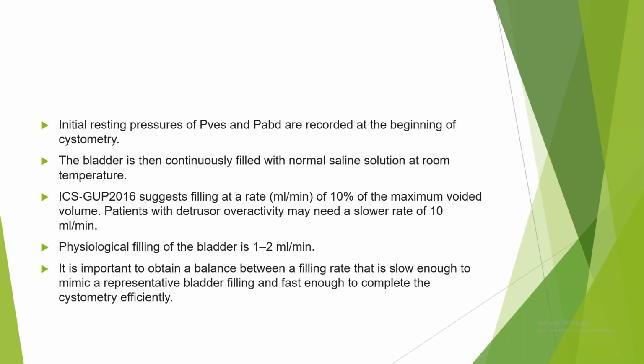Why is it important? Because rapid filling may cause some inadvertent changes, and we may not get the interpretation correctly. So we should use a balance: a filling rate that is slow enough to cause physiological filling, and that will not waste our time also.